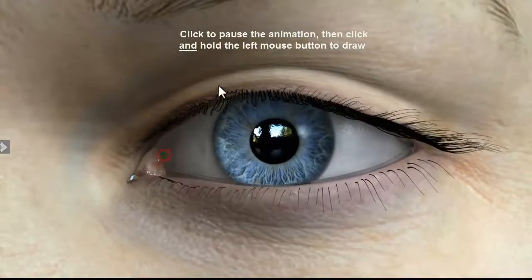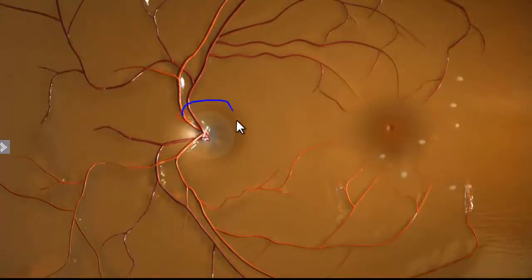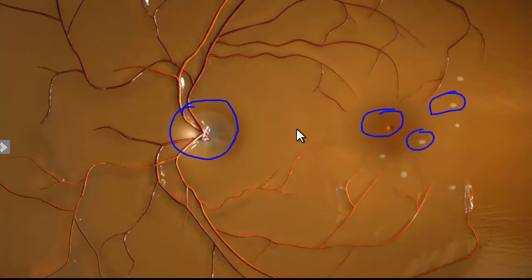In this case, we can explain that AMD doesn't occur at the front of the eye. If we fly through the eye, AMD occurs on the retina and we can highlight and draw over the optic nerve and macula and even pinpoint the drusen that we see here.